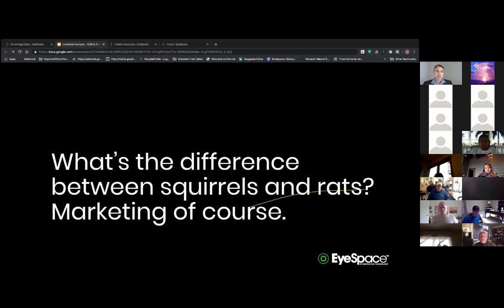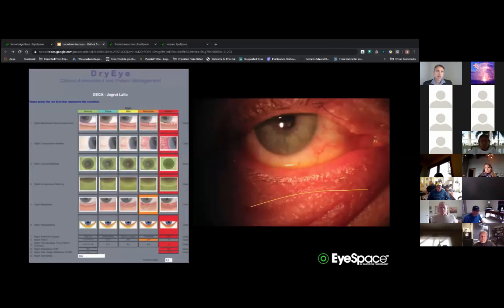Obviously, it takes more management. So all I want to add here is a practical tip, and this is when we remove the Ortho-K lens. Typically with these dry eye patients, there is a higher risk of getting lens adherence in the mornings. And so if this lens is tightly adhered to the epithelial cells and the patient just wakes up and takes his DMV remover and pulls the lens out, there is a higher risk of pulling some of those superficial epithelial cells off. And you'll see this as a central plug.